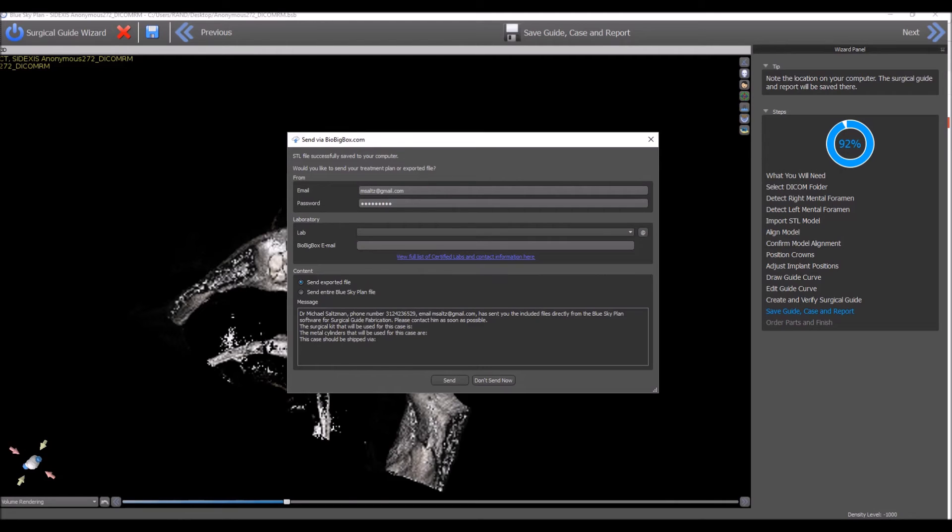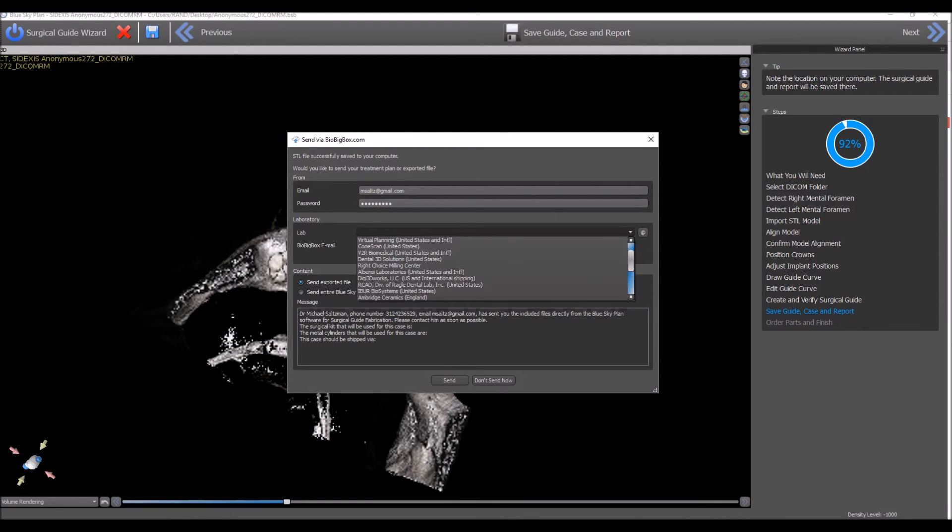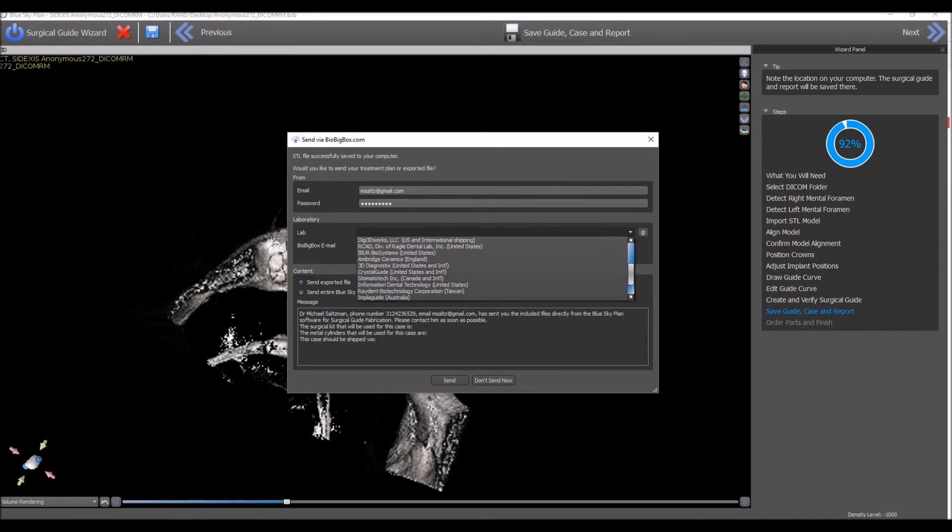As part of this stage, the BioBigBox transfer screen comes up, very similar to the previous screen. You enter your email address and your password for BioBigBox. In the second section, we've included a drop-down list of laboratories that could help you with surgical guide fabrication.